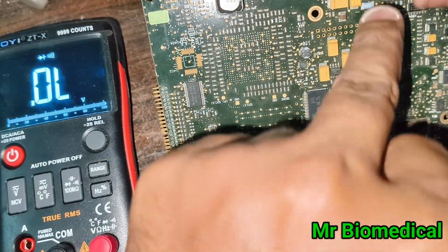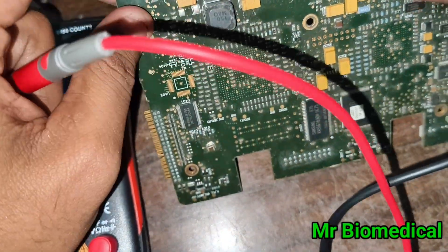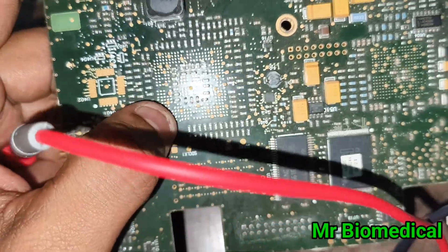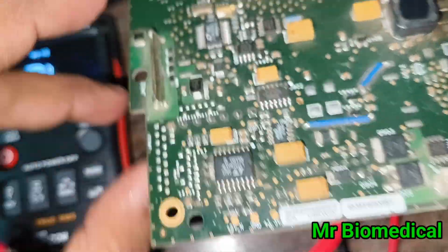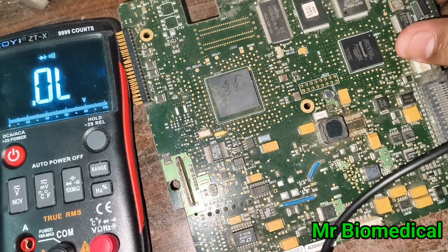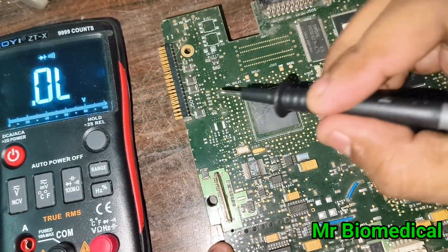Don't go for ICs first of all, because there are a lot of other possibilities. Sometimes you can see issues through visual inspection — like breakage or burn marks visible to the naked eye. Do a thorough visual inspection before probing ICs.